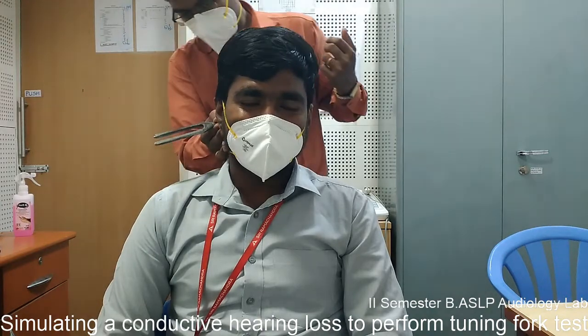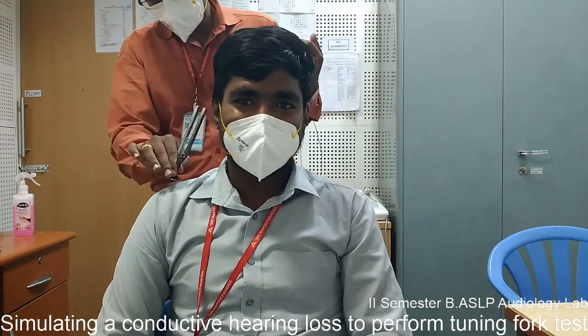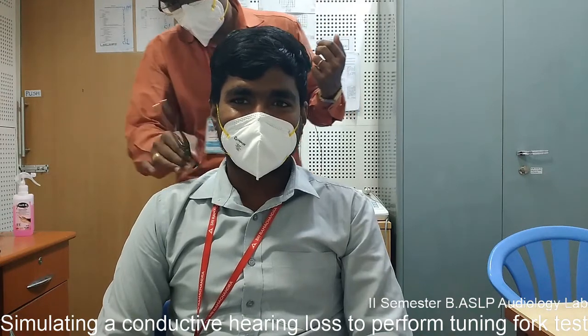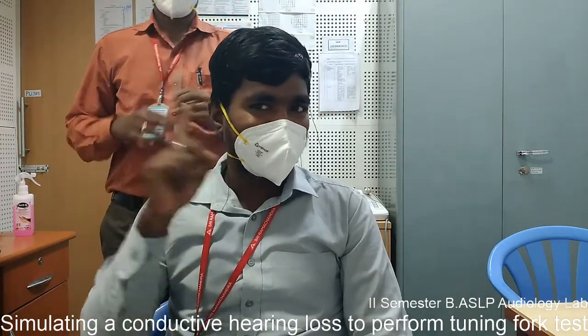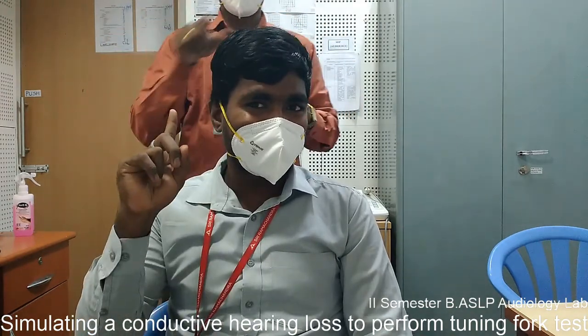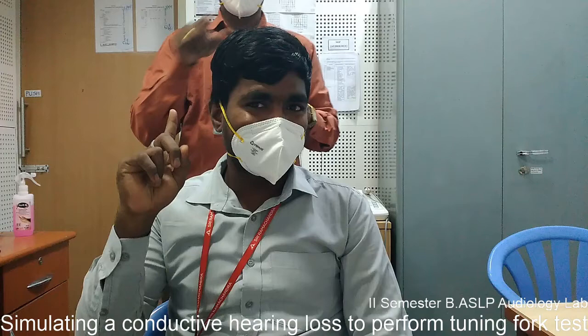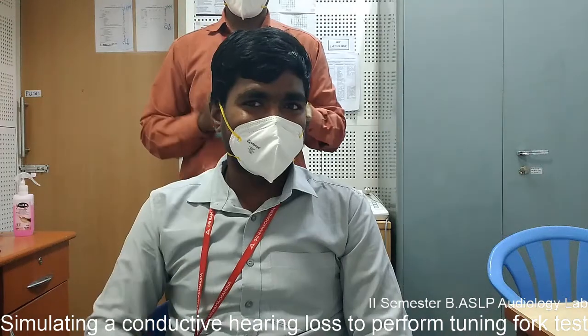Negative Rinne suggests the subject has conductive hearing loss on that side. Now let us see the same Rinne test on the other unoccluded side. On the unoccluded side, the Rinne test reveals the subject hears the sound louder in front of the ear canal, which means air conduction is louder than bone conduction. So on that side the hearing should be either normal or sensorineural hearing loss.